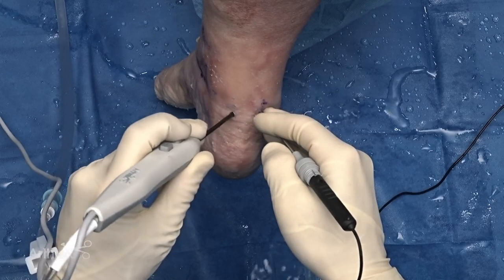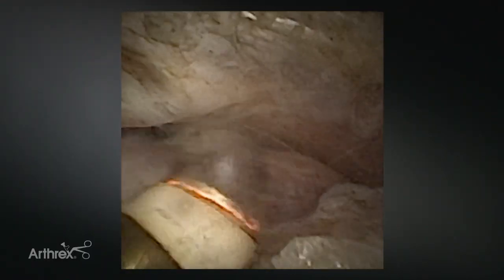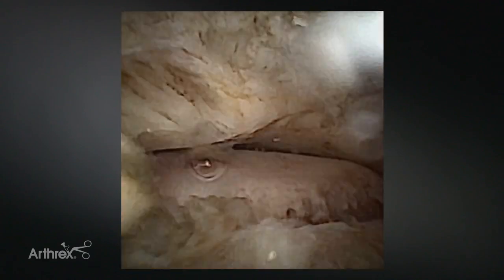When doing posterior scope as you begin to establish visualization, the SJ works really nice using a side-cutting effect to work the posterior subtalar joint, allowing good visualization and careful, meticulous dissection. Just slowly take your time, visualize the joint — it's all about safety and control.